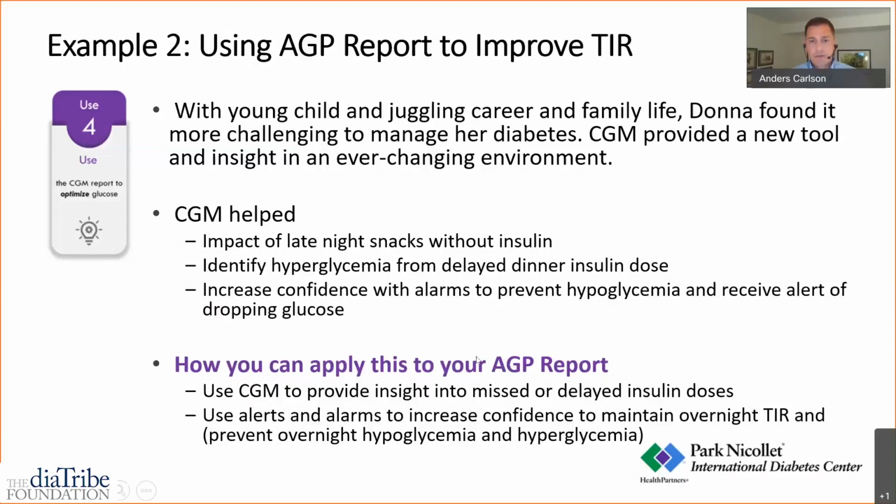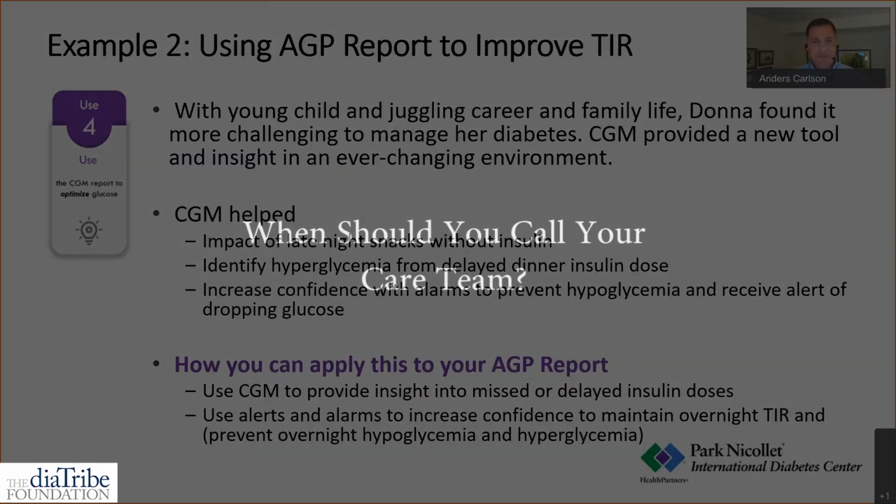And so takeaways from this case, really rely on that CGM to give you insights about missed or delayed doses, particularly around meals and snacks later into the evening. And then also, again, really rely on those alerts and alarms to help build confidence, not only overnight, but with exercise and with other changing time periods in the day.